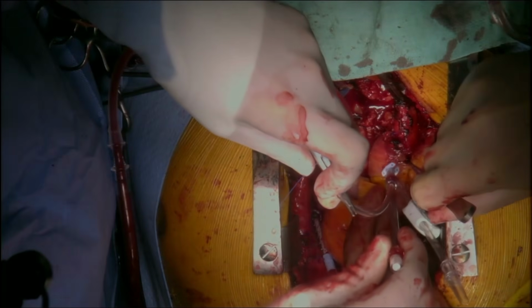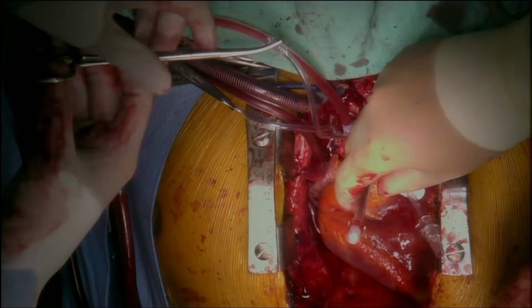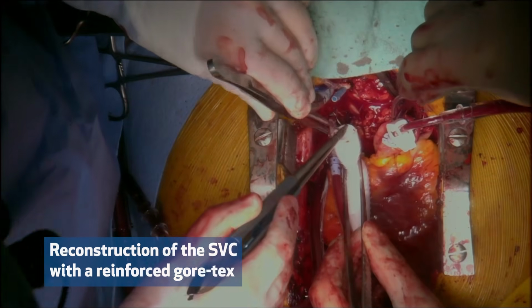A root vent is positioned into the donor aorta for the de-airing, and finally the superior vena cava is reconnected to the right atrium with the interposition of a reinforced Gore-Tex conduit.